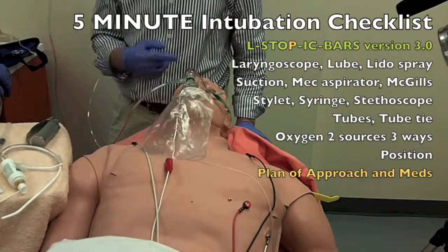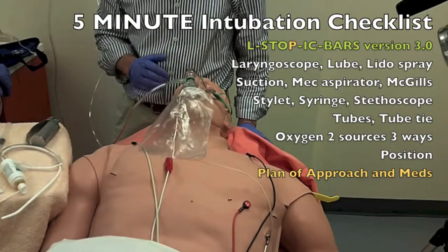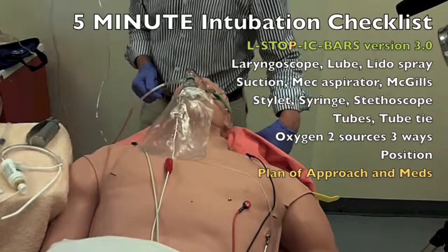Okay. And then we're going to wait about 45 seconds. I'm going to check to make sure that he's paralyzed, not breathing anymore, completely relaxed. And then we'll go ahead with direct laryngoscopy, bougie intubation as my first attempt, the best attempt.